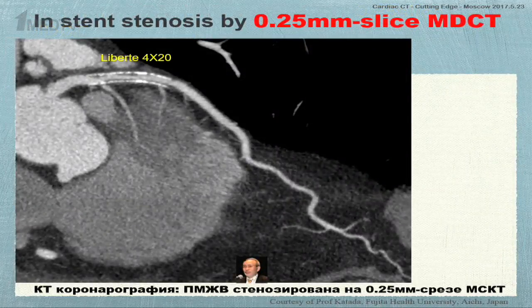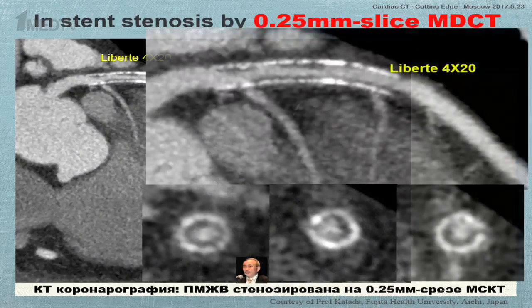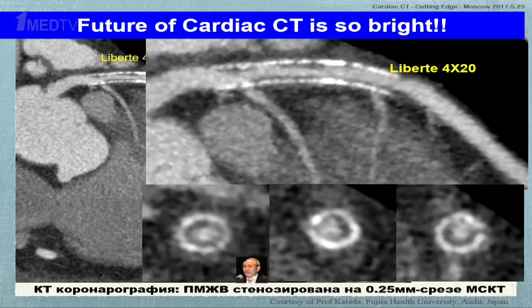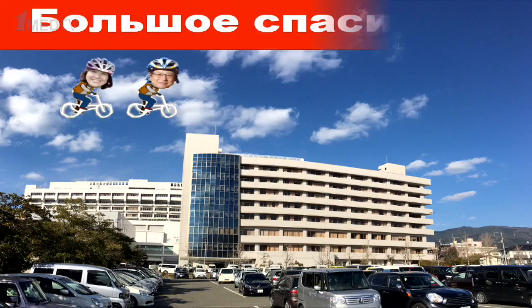And this is the in-stent stenosis. Again, here you can see the in-stent plaque so clearly. This is the courtesy of Professor Katada at Fujita Health University. So the future of cardiac CT is so bright, brilliant.